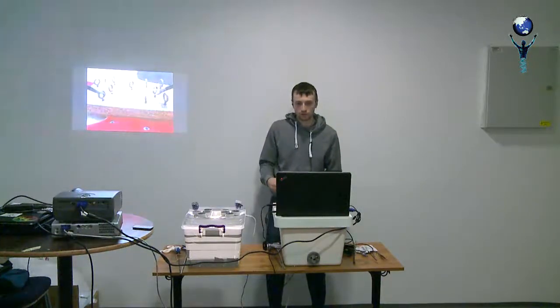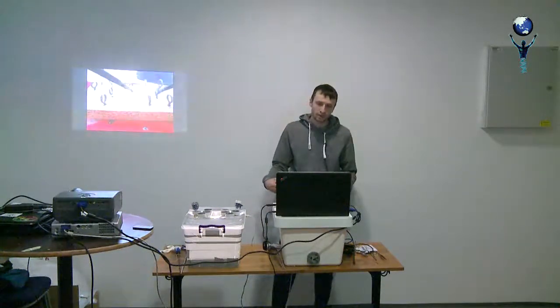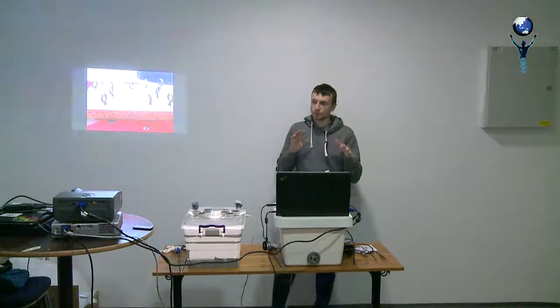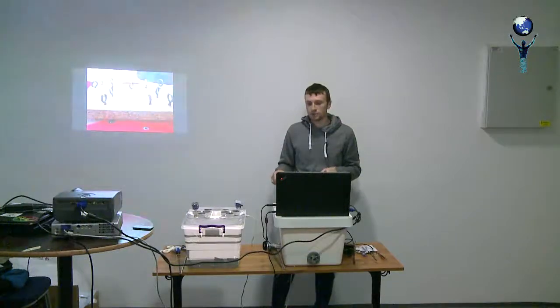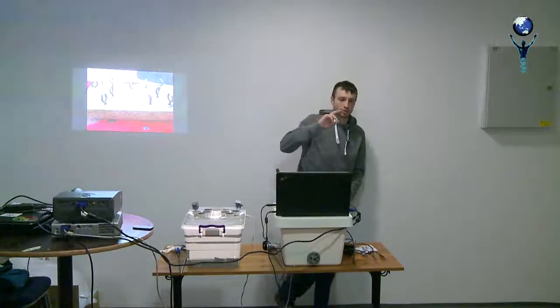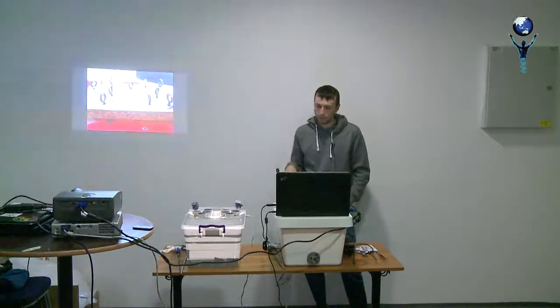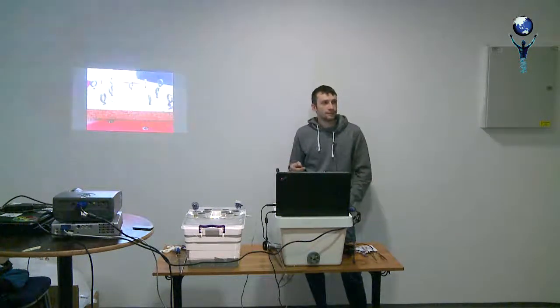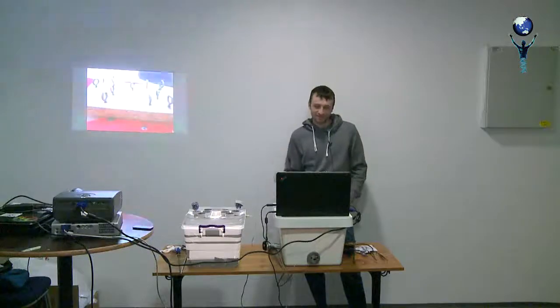So it's not an easy job, it's just for hands and eye coordination, and because the laparoscopic approach is in 2D, not 3D like real life, the depth perspective is so different. First of all, you can define which is deeper and which is nearer to you. Maybe this is the first task for you, in couples. One can hold the camera and help you, another one makes the task and then switch. Which will be the first couple? Come on.